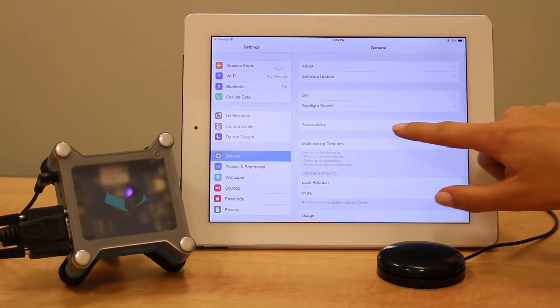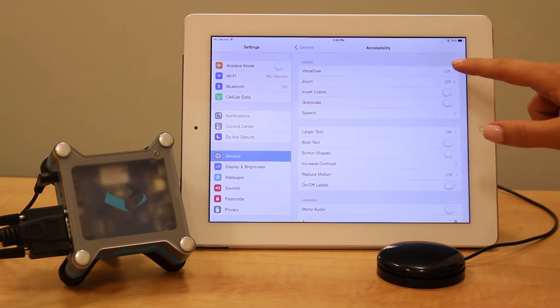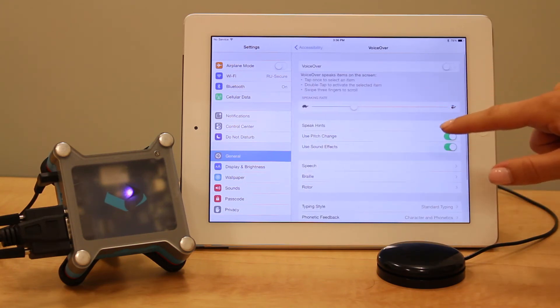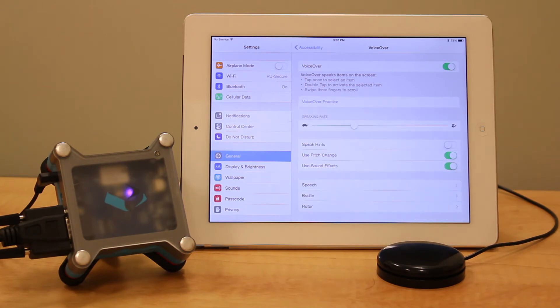Go back to General Settings and click Accessibility. Scroll over to VoiceOver and turn it on. You'll then see a black frame that highlights the items on your screen that you can now control using the Tecla Shield.